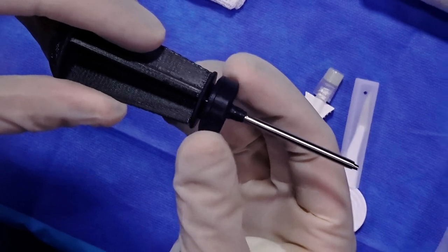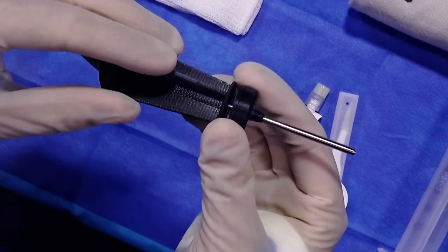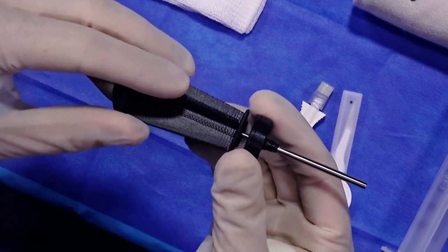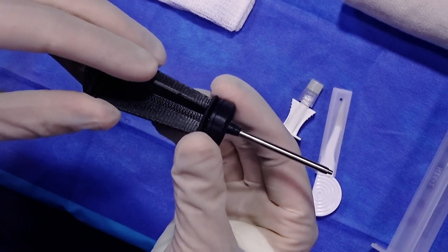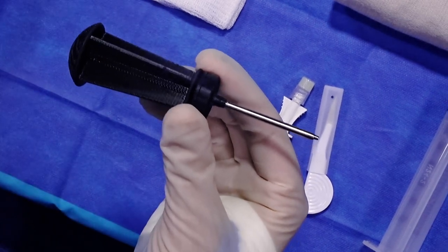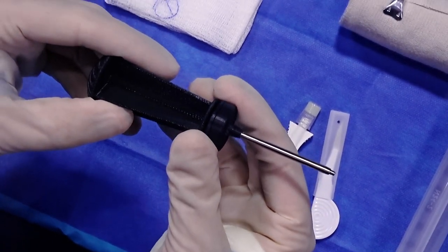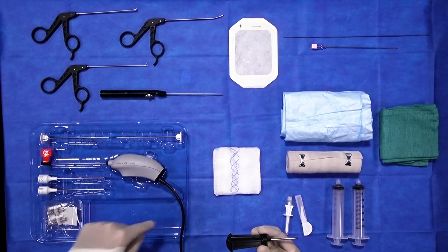It's important to emphasize how atraumatic and small this is relative to our conventional tools. With our routine 3.5 millimeter scopes, the outer diameter of those cannulas is six and a half millimeters — very large — and correspondingly the tools that we use to instrument are quite large. This is an outer diameter sheath of 3.0 and all of the instrumentation going into the knee joint is 2.0.